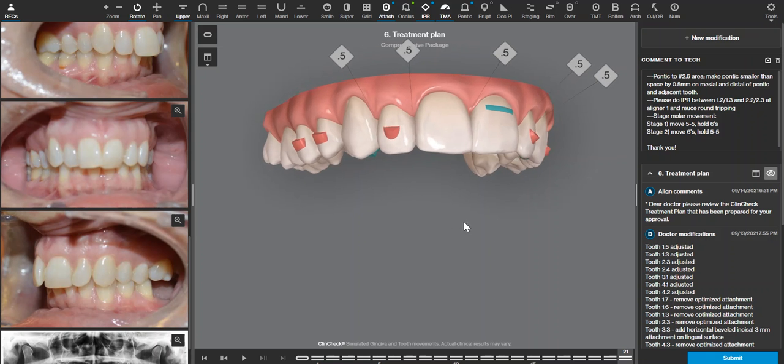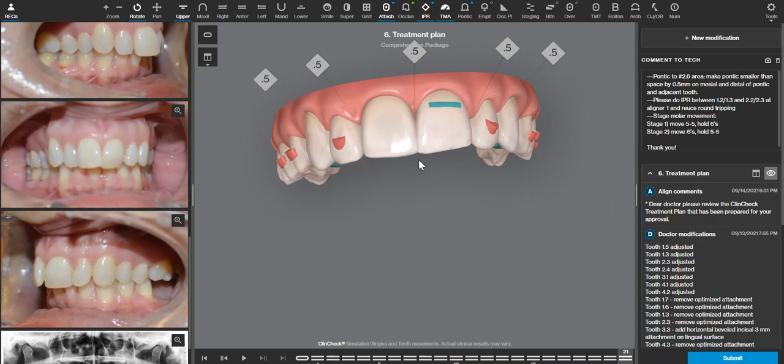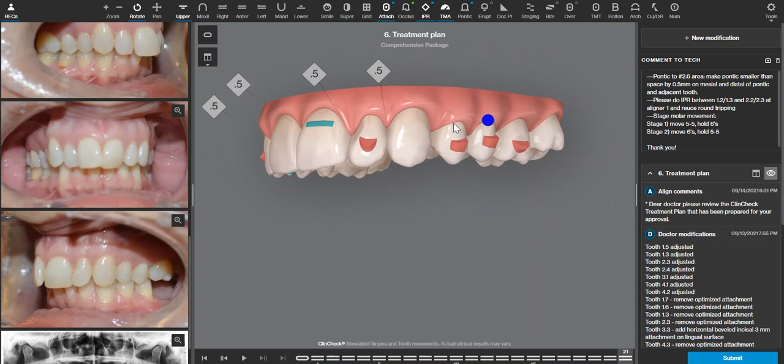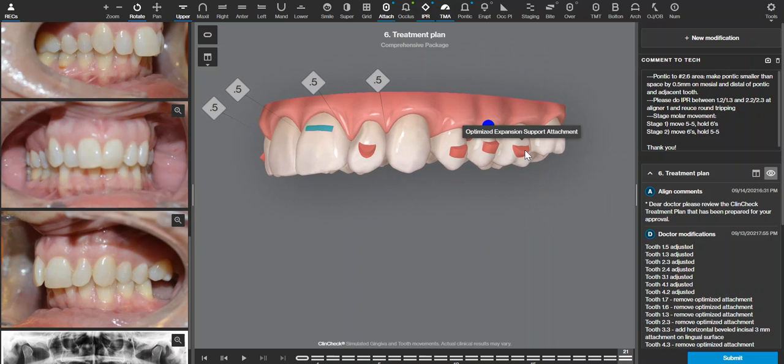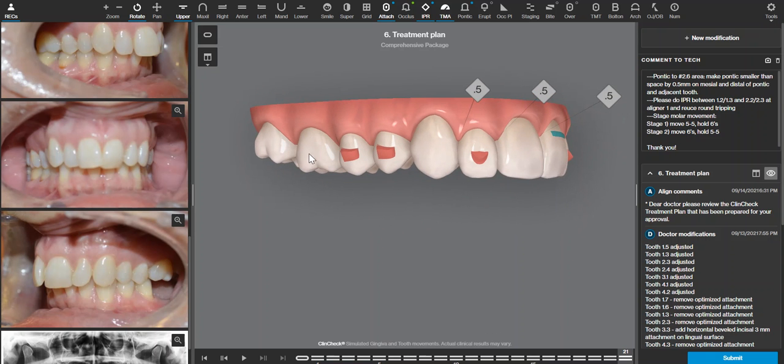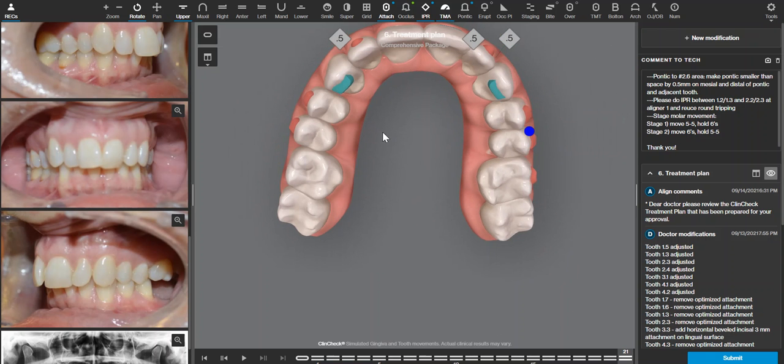Her upper molars are already upright, so those would be technically expanded. This molar already has the expansion support attachment. I'm going to ask for the same thing on the other molar.